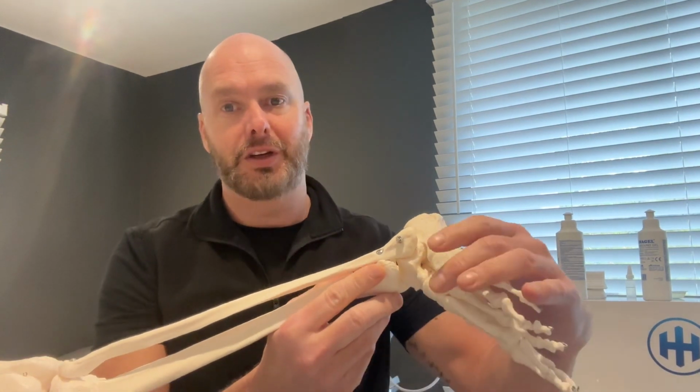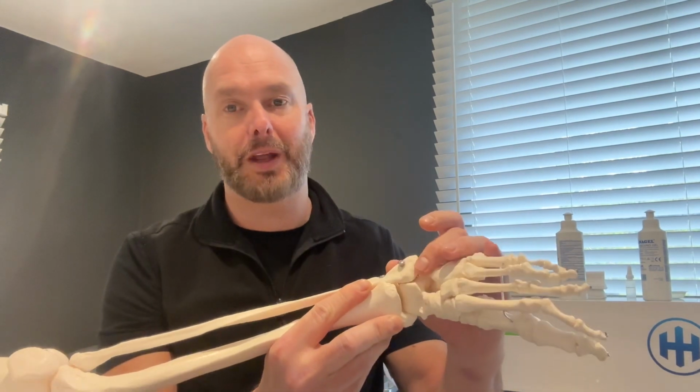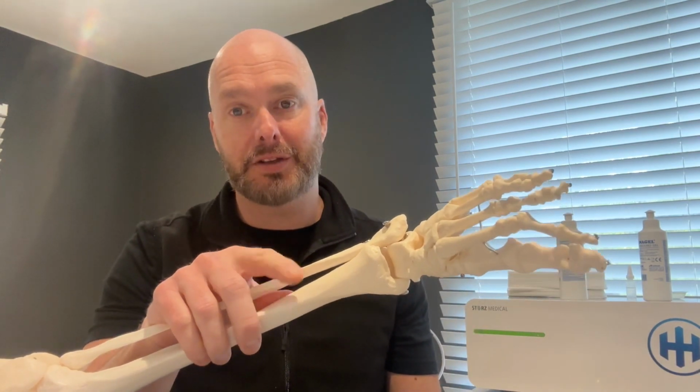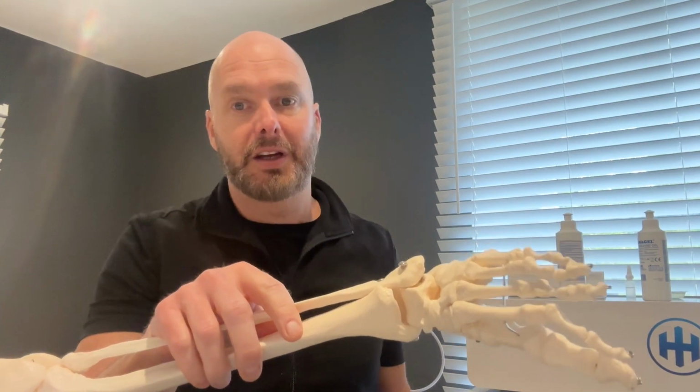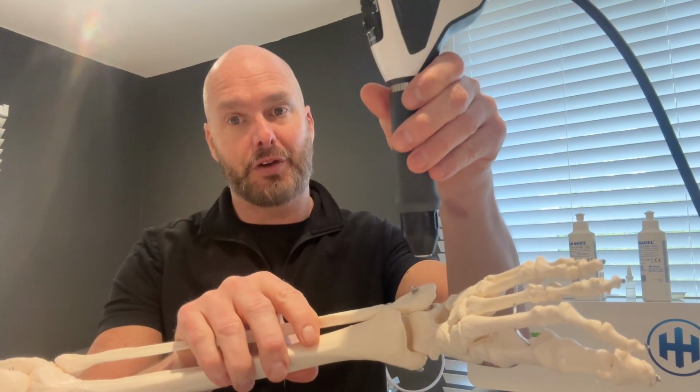So that's a great way of identifying the ligament. However, if you've got a patient who's got a painful ligament when you dorsiflex and internally rotate the foot, then obviously you're going to find out where that painful bit is. Most of the time, its origin is from the lateral malleolus, so this fibula there. And if you were to take your radial device and start to try and treat those ligaments, your patient goes straight through the roof like a firework. It's not going to work. Now, I have shown you tender areas where you build up quite a height of the gel over that area, almost creating a focus level standoff, and you gradually work your way closer and closer. But this just isn't going to get you any kind of result because it's just too painful in that area.